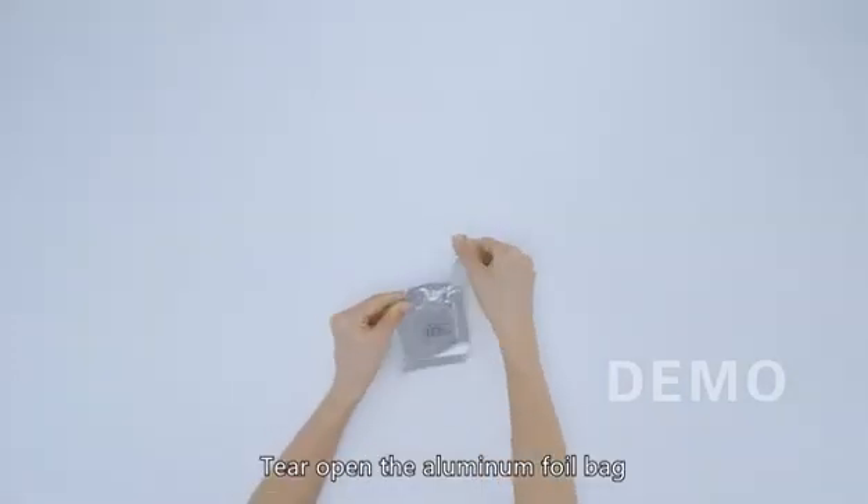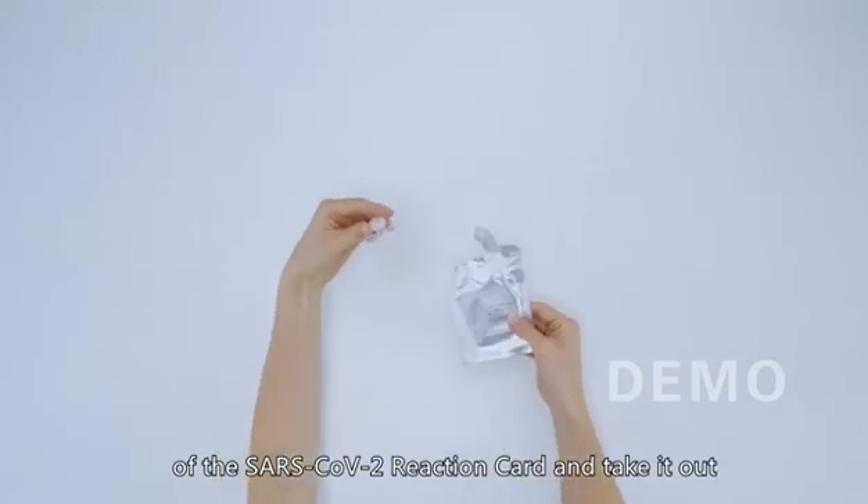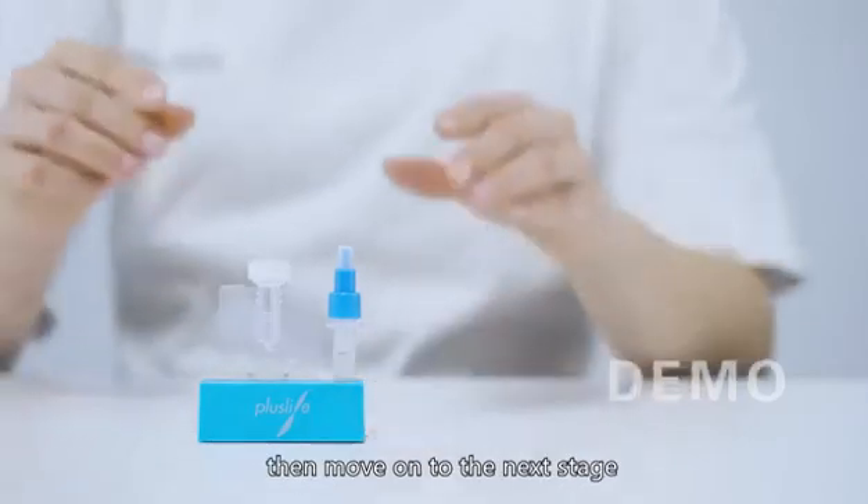Tear open the aluminum foil bag of the SARS-CoV-2 reaction card and take it out. Place it on the card holder, then move on to the next stage.